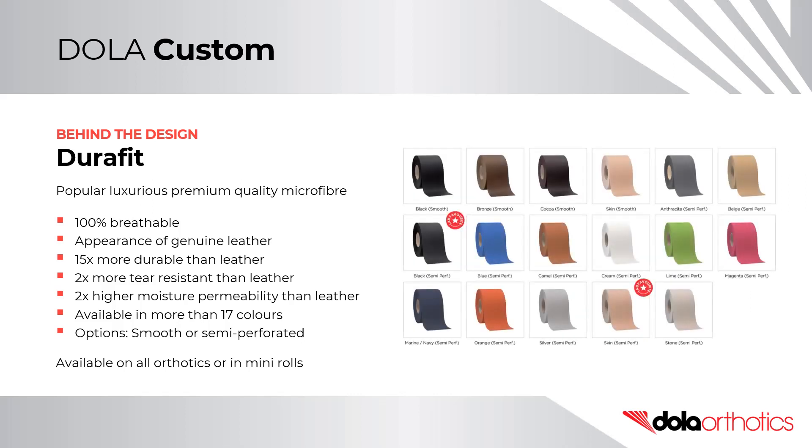Durifit is available in more than 17 colours. Options include a smooth top surface or a semi-perforated surface. It is available on all custom and prefabricated orthotics, or in mini-rolls.